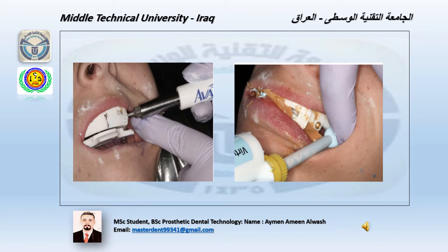Adjust the occlusal vertical dimension by turning the fitting on the side screw of the AMD to raise and lower the central bearing pin and material injection between maxillary and mandibular tray.